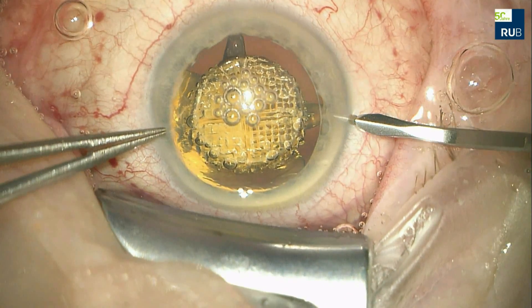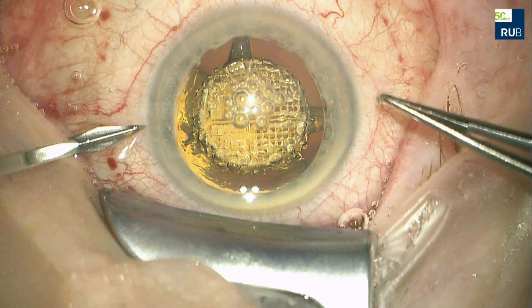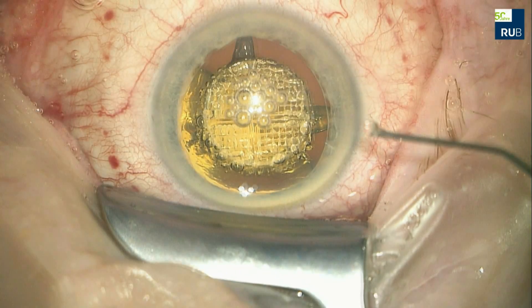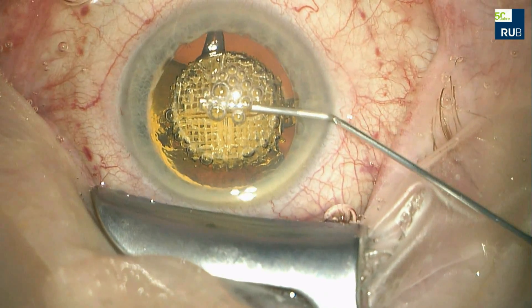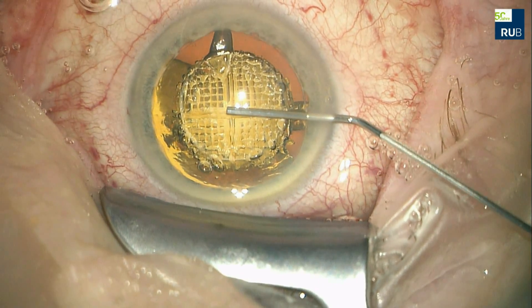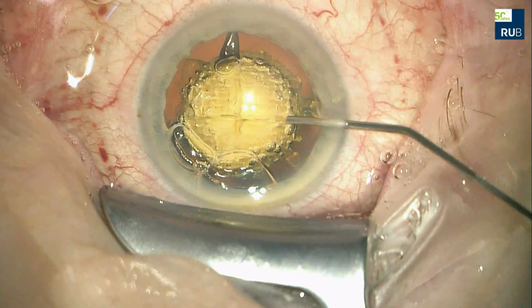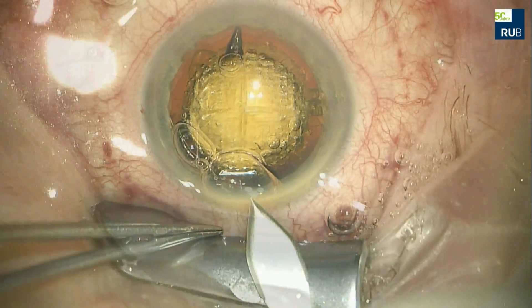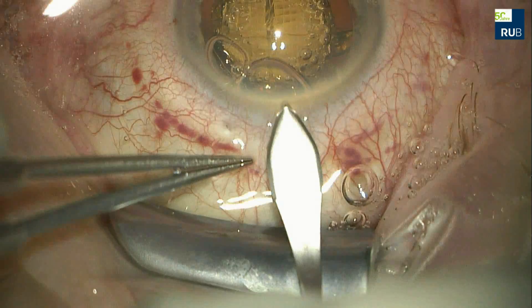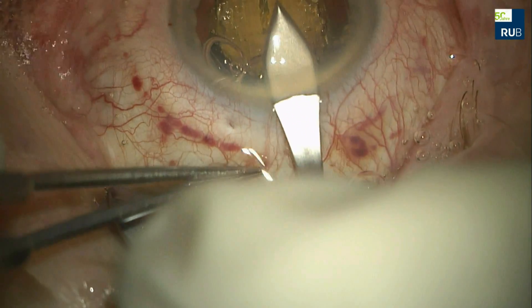Two side port paracenteses are made. The anterior chamber is now filled with Helon viscoelastic. A superior limbal incision at 12 o'clock is made to remove lens fragments.